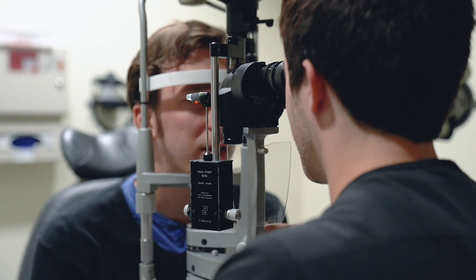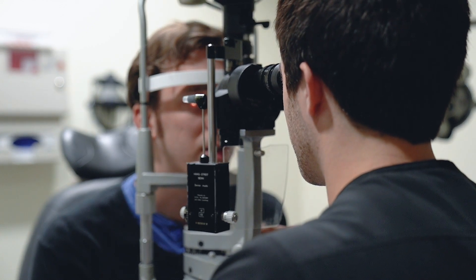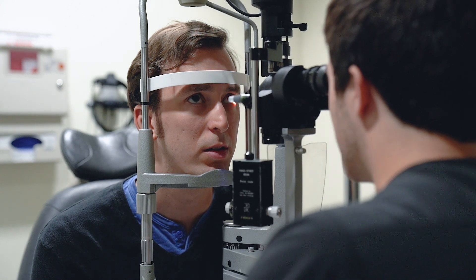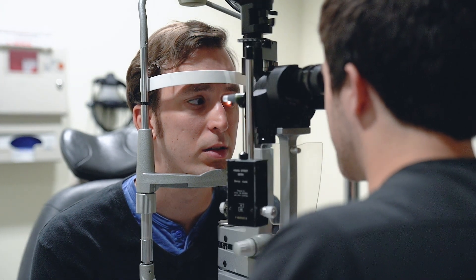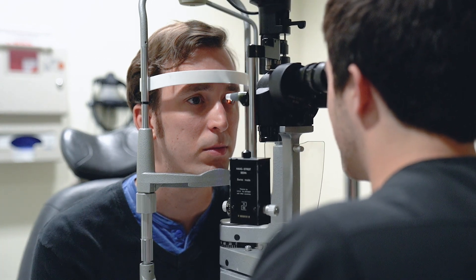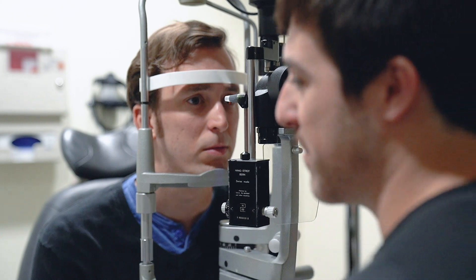And really it doesn't quite catch it — it's just kind of like having a fog. Look up towards the ceiling again, and to your left, to your right, and look down, and straight out again.